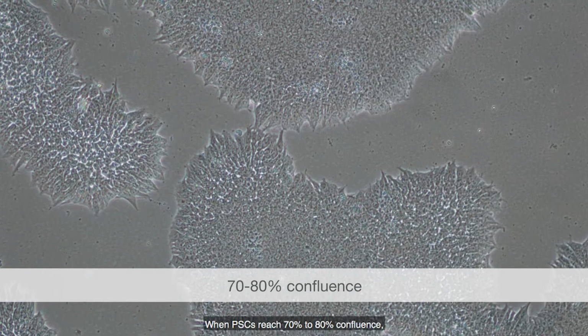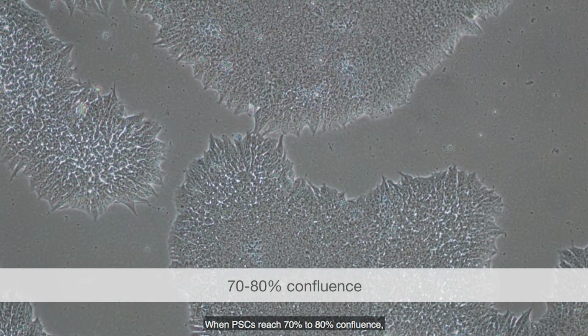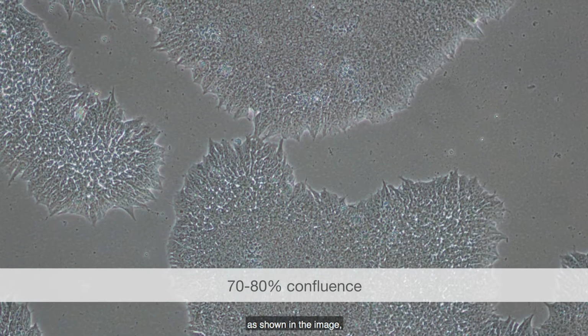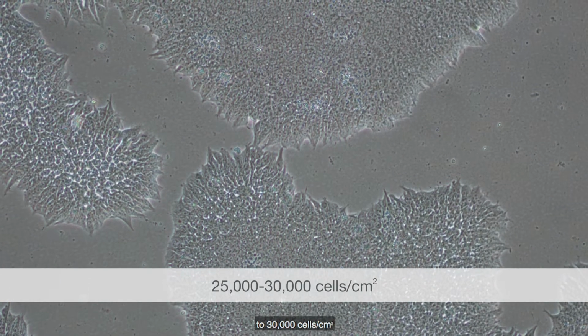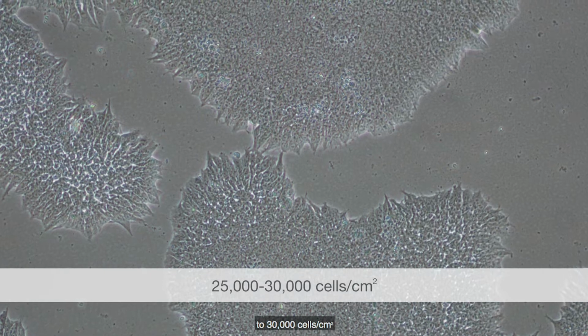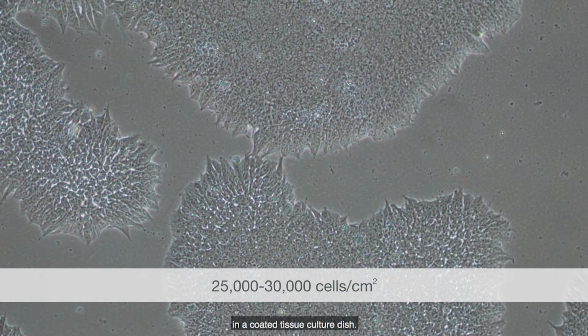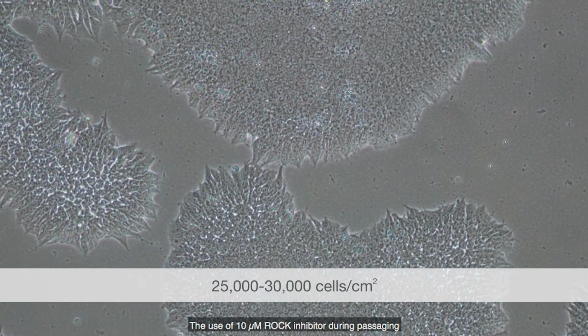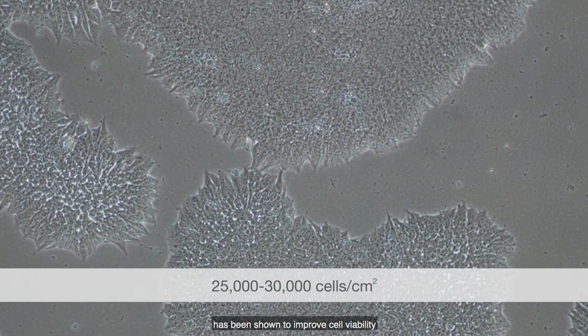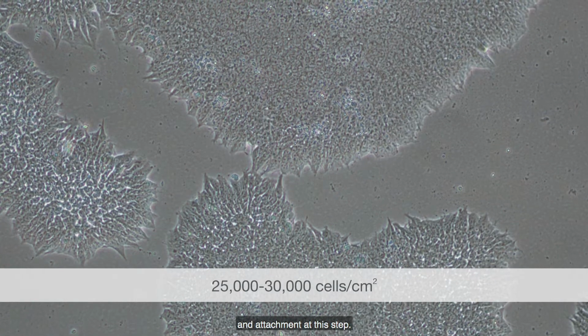When PSCs reach 70% to 80% confluence, as shown in the image, passage and plate PSCs at a density of 25,000 to 30,000 cells per centimeter squared in a coated tissue culture dish. The use of 10 micromolar ROCK inhibitor during passaging has been shown to improve cell viability and attachment at this step.